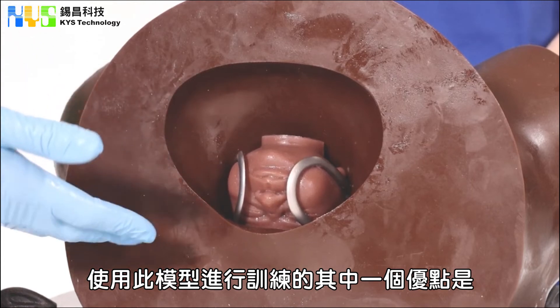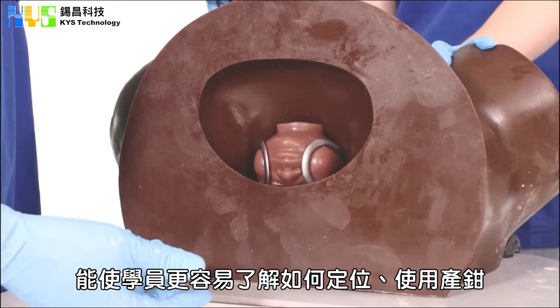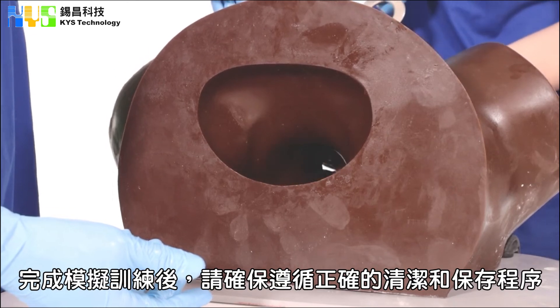One benefit of the Lucy's Mum Simulator is the ability to look at the back and see where the forceps are placed on Lucy's head. This will give your student a better idea of how to position the forceps.